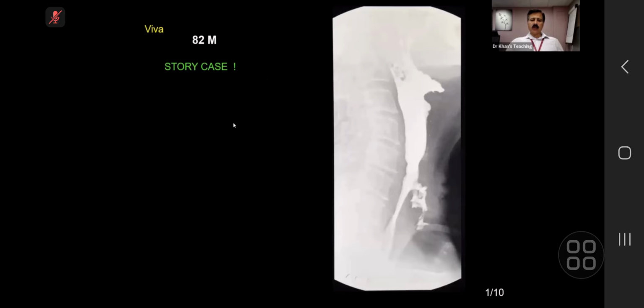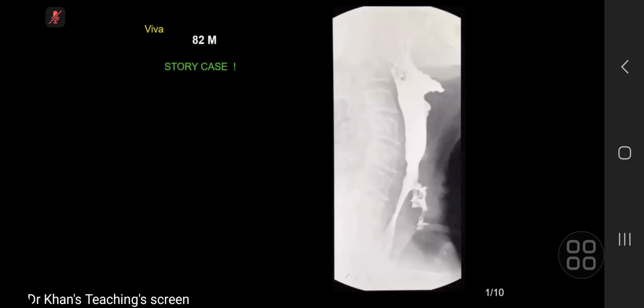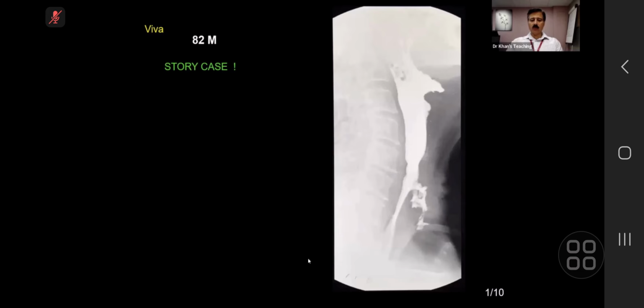Now, this case, I want all of you to concentrate. This is a very good teaching case, learning case. I want you to concentrate. And after this, I'll give you a 5-minute break, and I'll go into a bit of a teaching mode on this case also. So over to you, candidate 9. Let me give you a hint that this is a story case. It tells you a story, and you will tell me what is the story.